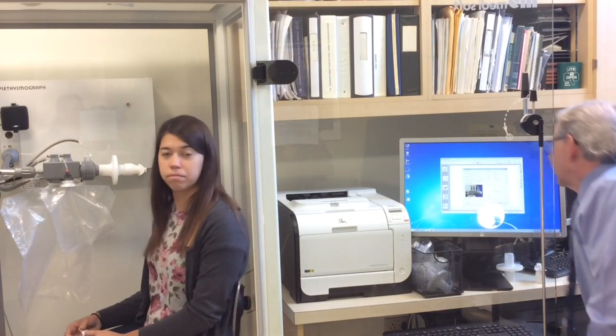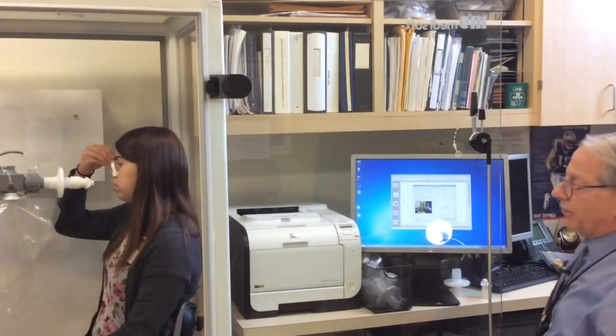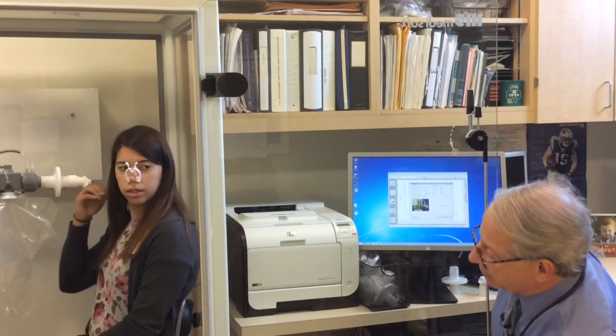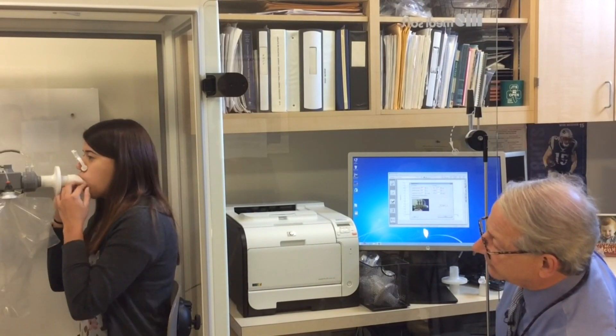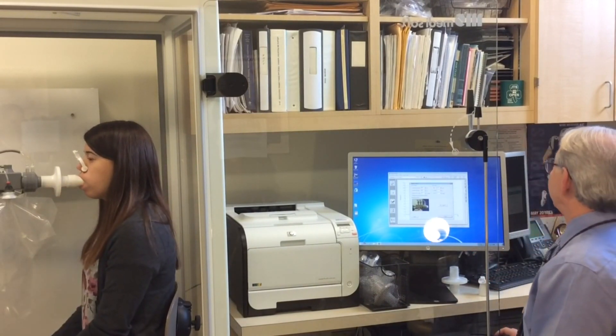Okay, all right. I think we're ready. So Danielle, you can place your mouth on the mouthpiece, clips around the nose, just breathe easy.